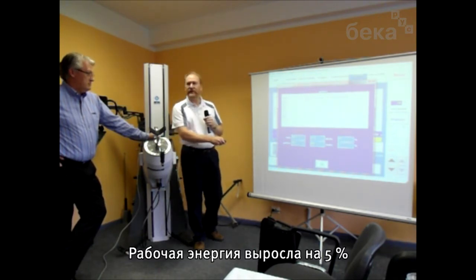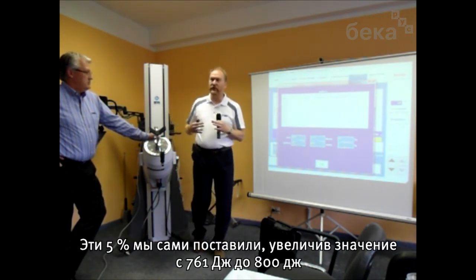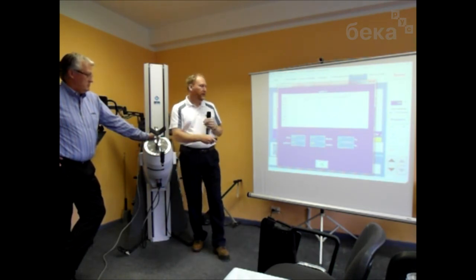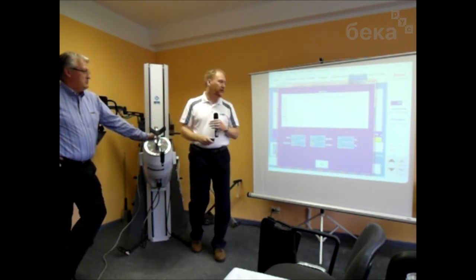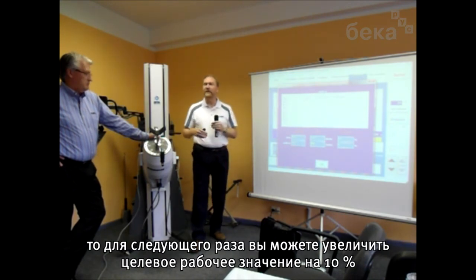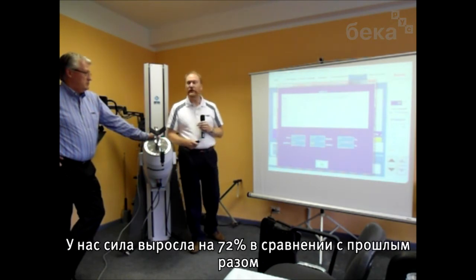Work increased 5%. Now that 5% change is something that we as the therapist control because we set work as the goal. So the change from 761 to 800 is something I set, so I controlled that 5% increase in work output. But the power output is a change based on his actual performance. And you can look at that number, and again, using that speed protocol, if you see a power increase of 10% or more, the suggestion is for the next time the person comes in, you increase the work goal by 10%. So his power increased 72% from last session.